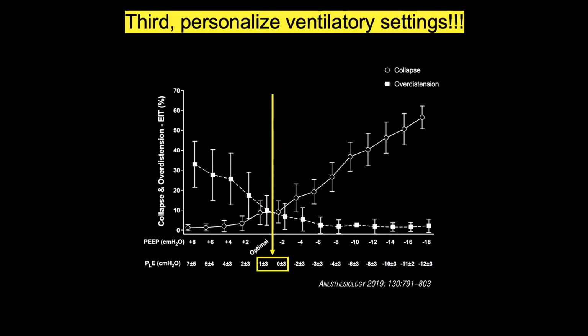So we have a new way to measure something that, from a physiology base, everyone believes: slightly positive end expiratory transpulmonary pressure represents a safe range of PEEP to avoid overdistension and collapse. And in a non-invasive way, using EIT, the crossing point matches with this assessment.